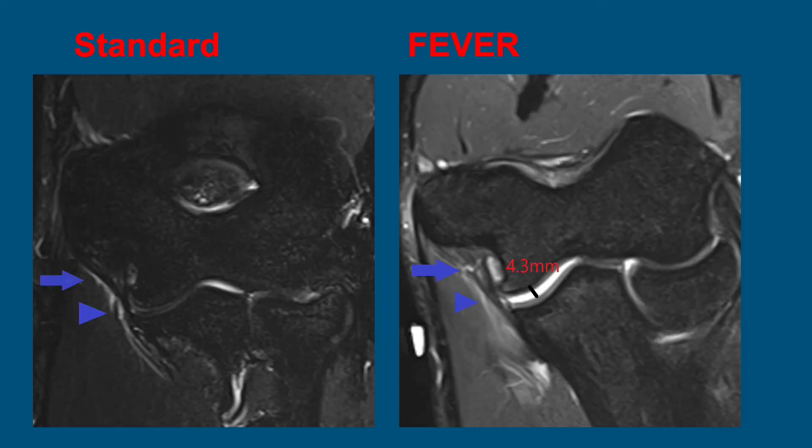The next patient experienced pain after one pitch. We can see some periligamentous edema superficial to the UCL and a small amount of intrasubstance signal on the standard view. On the FEVER stress view, we see mild widening of the joint space to 4.3 millimeters and a partial tear in the proximal anterior bundle along with periligamentous edema. So this represents a partial tear and sprain instead of just a sprain as seen on the standard image.